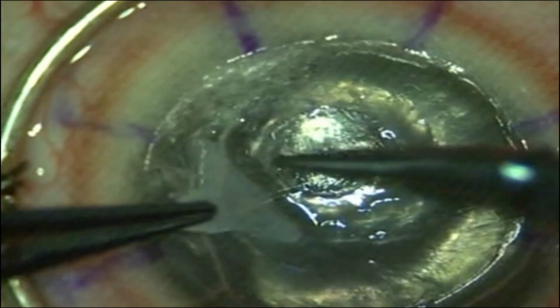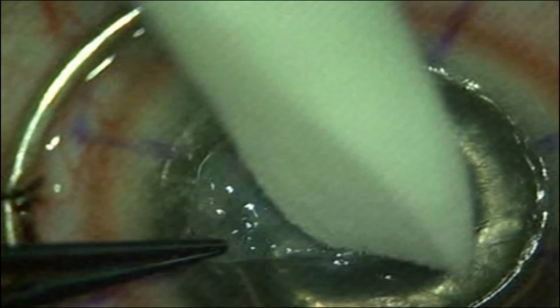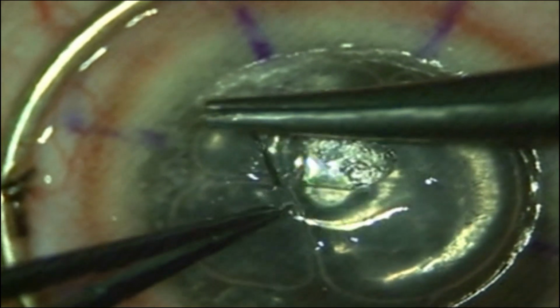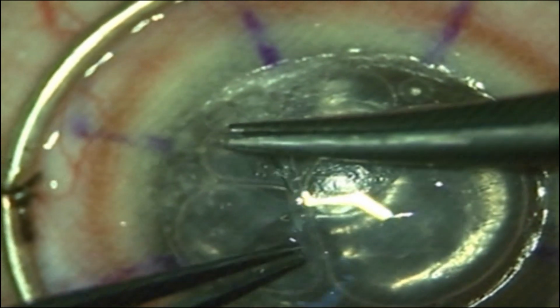The frequent escape of the air bubble from the anterior chamber through the perforation had to be dealt with using a 10-0 nylon suture application.